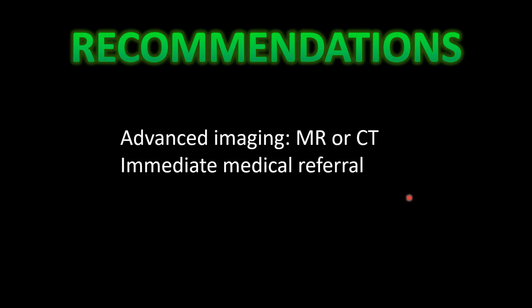My recommendations at this point are to get the patient from the chiropractor to an immediate medical referral, as well as advanced imaging. Either MRI or CT would do the job, but I recommend MRI in order to fully evaluate the soft tissues.